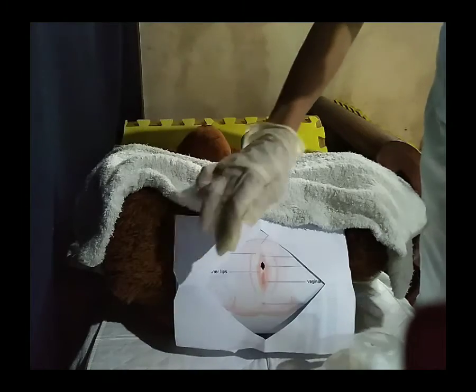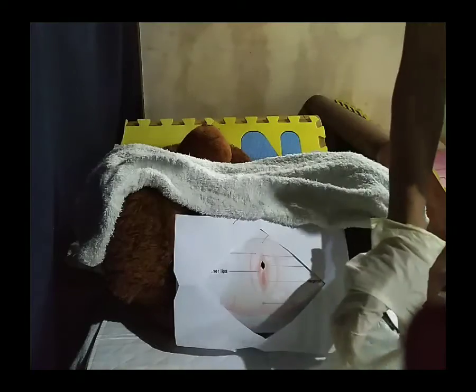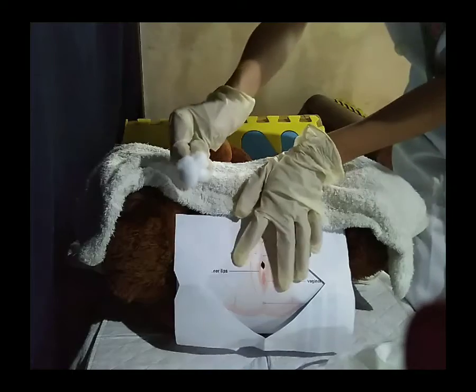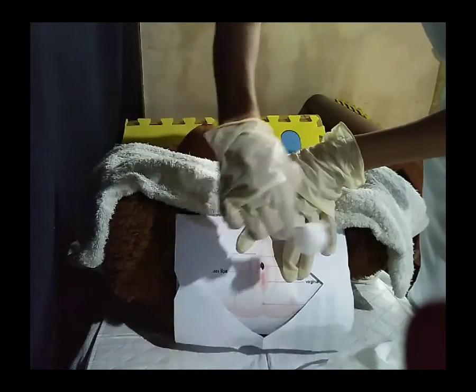So first, we're going to wipe the left side from top to bottom, then dispose of it. Using our cotton ball, we're going to clean the labia. First, we're going to spread this. Dispose.